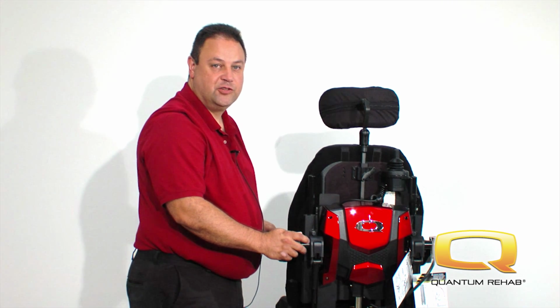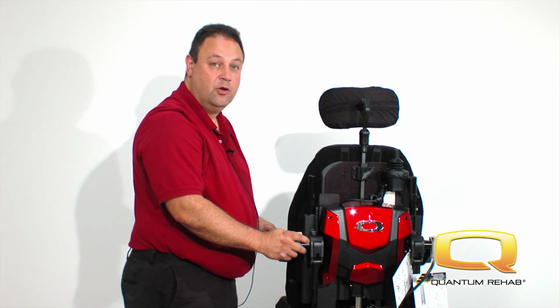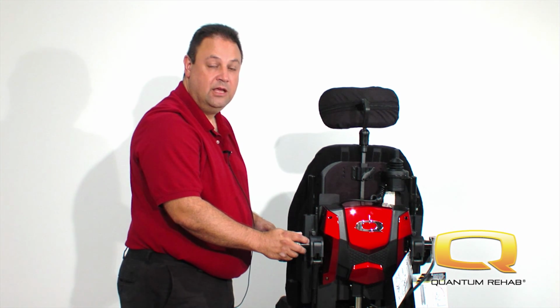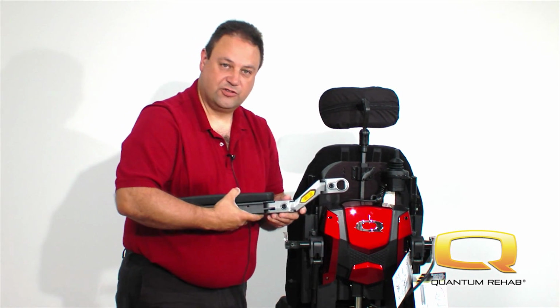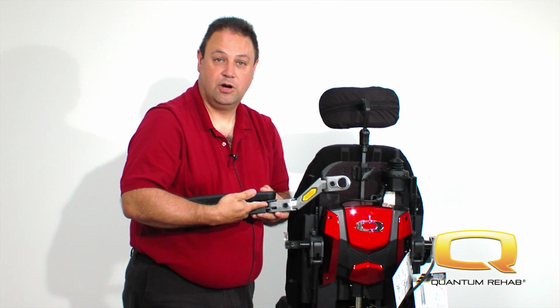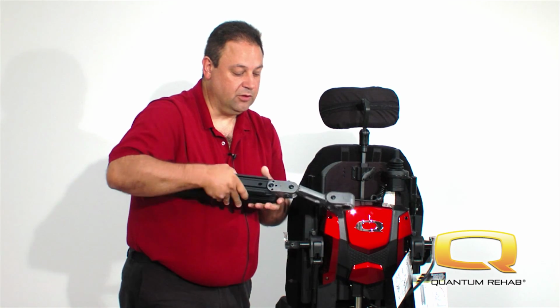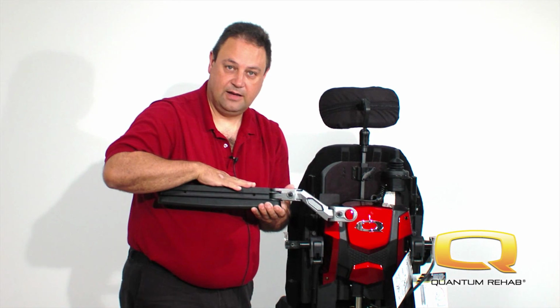With regards to arm height adjustment, the TB3 seating system has a lot of adjustability designed in mind. We go from 8 to 16 inches in overall height adjustment. When you review your order forms, you will see that they are broken down into two sections, 8 to 12 inches and 12 to 16 inches respectively. If you order a chair with 8 to 12 inch arm height adjustment, the arm will look just like this. Notice the offset is in the downward direction. If you order a 12 to 16 inch arm, the arm will look like this, 180 degrees opposite, and the arm pad will be located on the top.